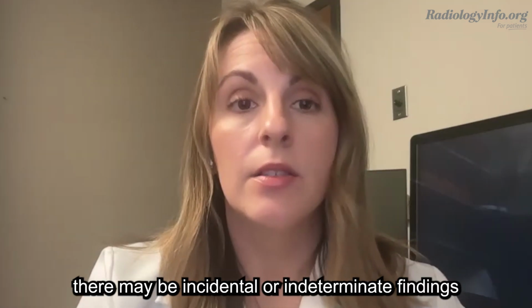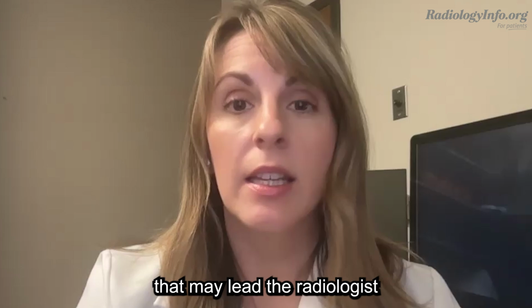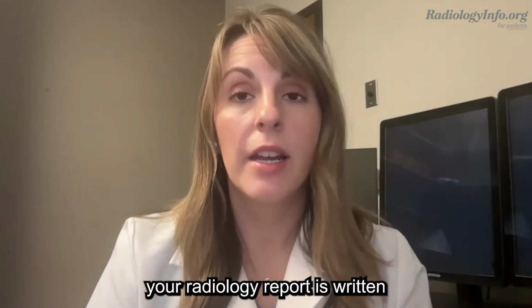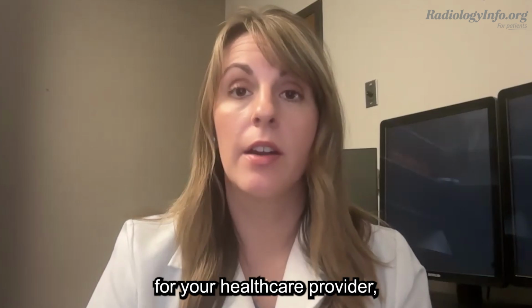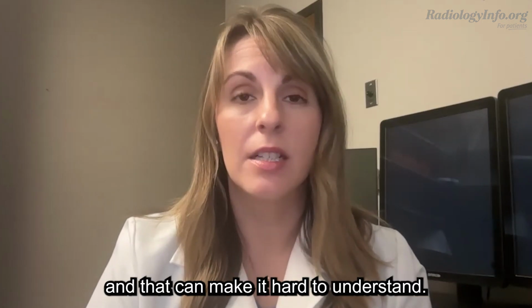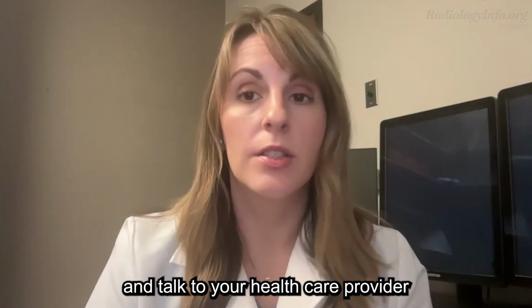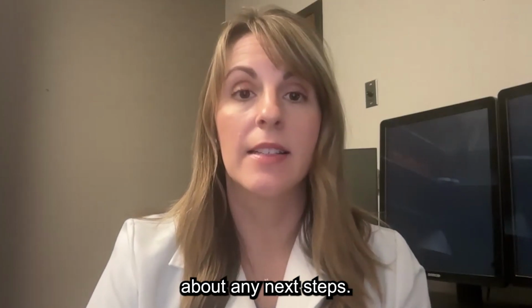There may be incidental or indeterminate findings that may lead the radiologist to recommend additional testing. Remember, your radiology report is written for your healthcare provider, and that can make it hard to understand. Write down any questions and concerns you may have and talk to your healthcare provider about any next steps.